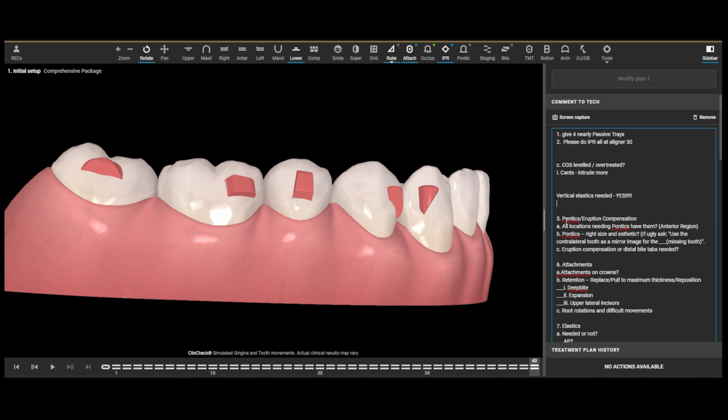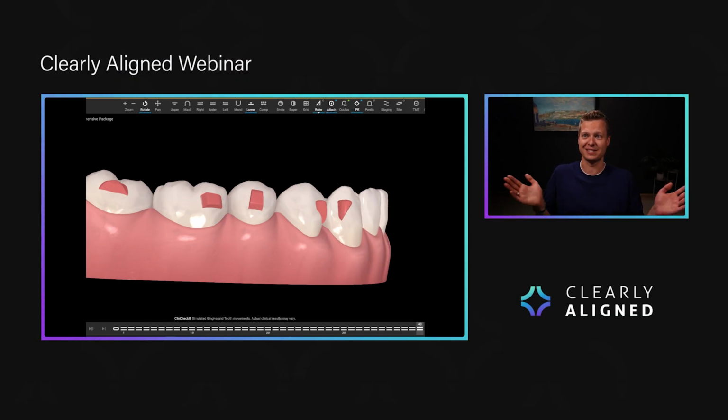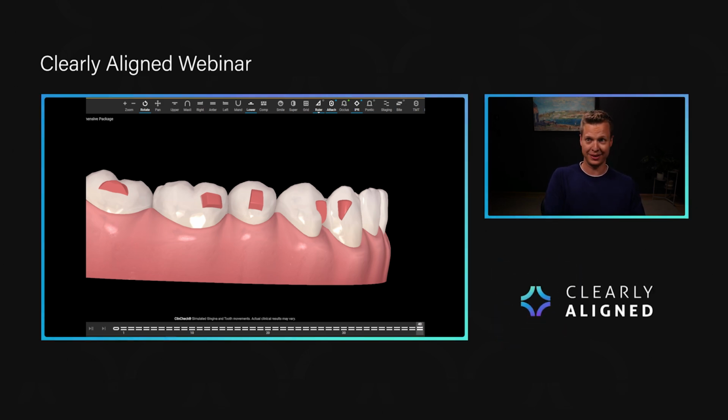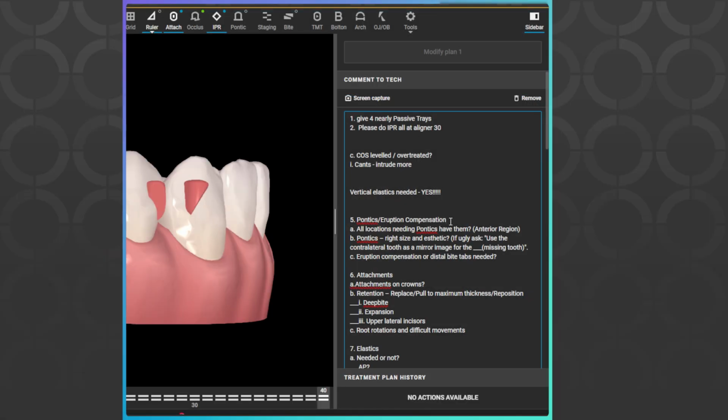But if they had given me only 12 trays here and said that that was enough to accomplish this, I'd say, like, no, I need way more trays. And if they gave me 100 trays, I'd say, well, do I really need that at 1 week per tray? That's 2 years. Is 2 years needed for this? No, that's overkill too. So is 10 months reasonable for the first round of trays? Yeah, totally. Okay, cool. Hopefully you guys aren't too bored.